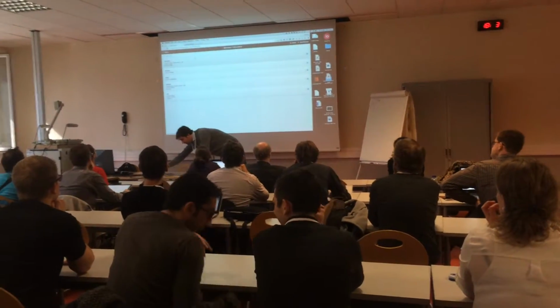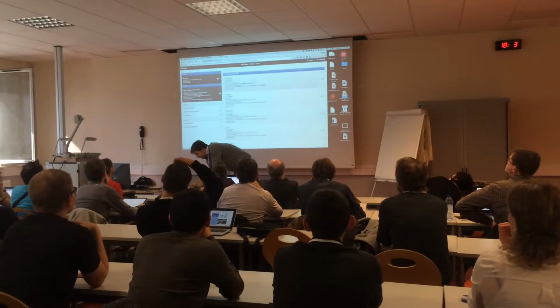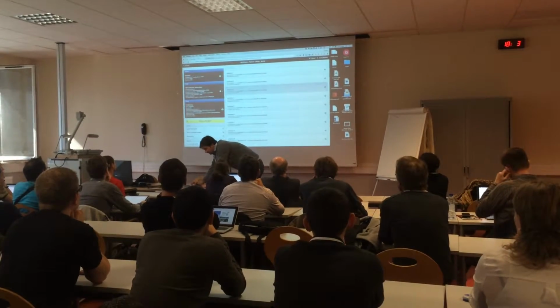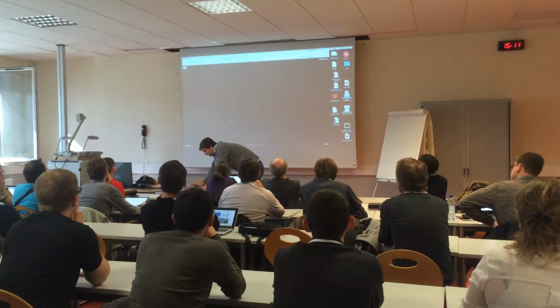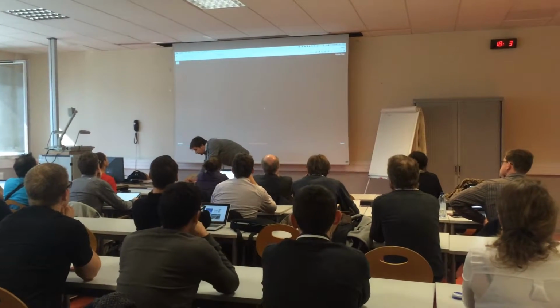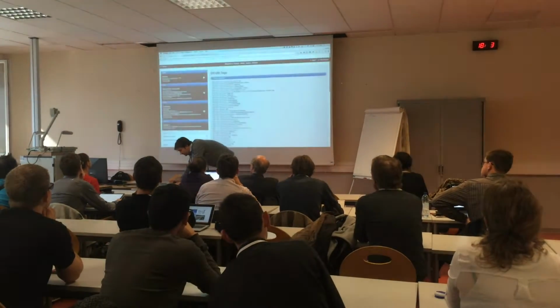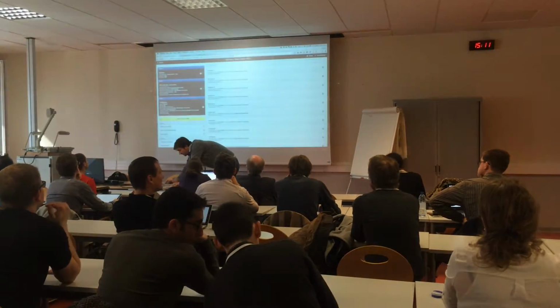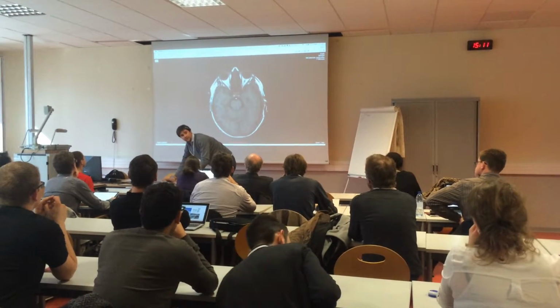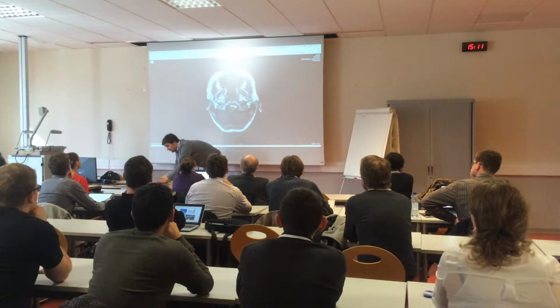A quick demo. This is what Orthanc looks like. It has an Explorer built right in. I hope the network is going to support this. So this is browsing study into the different series, the different instances. I can open the series and then hopefully browse within that. Start browsing. That's a basic viewer. It's only 2D. Nothing really complicated, but it already covers a big percentage of the needs.